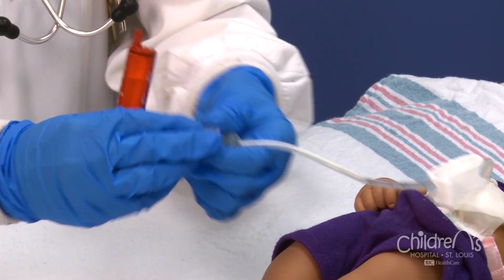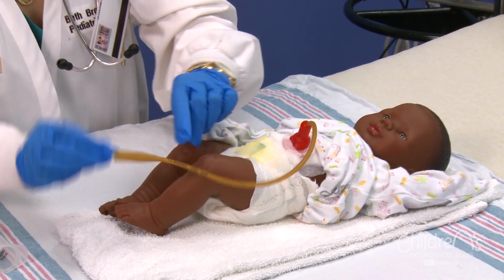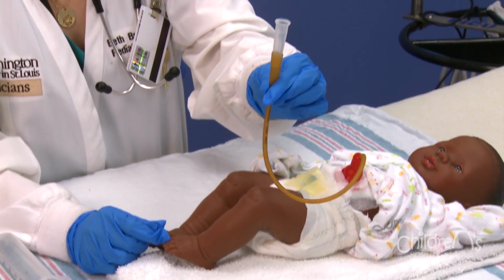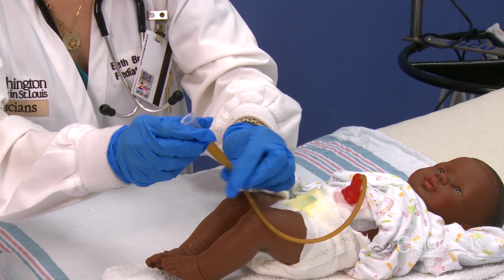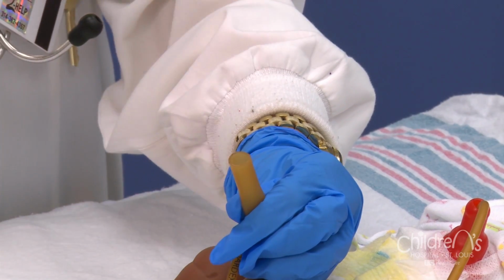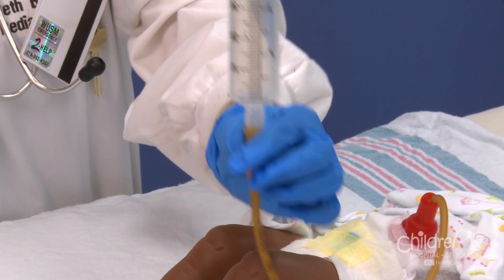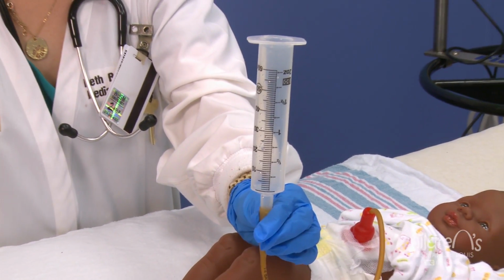If your child's G-tube does not have a medication port, the tubing will have only one large opening. To give medicines through this type of tubing, follow these steps. Remove the cap and rubber band if present. Attach the feeding syringe without the plunger directly into the tube.